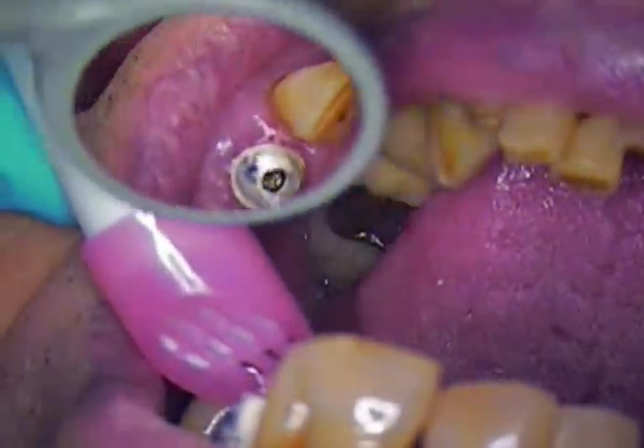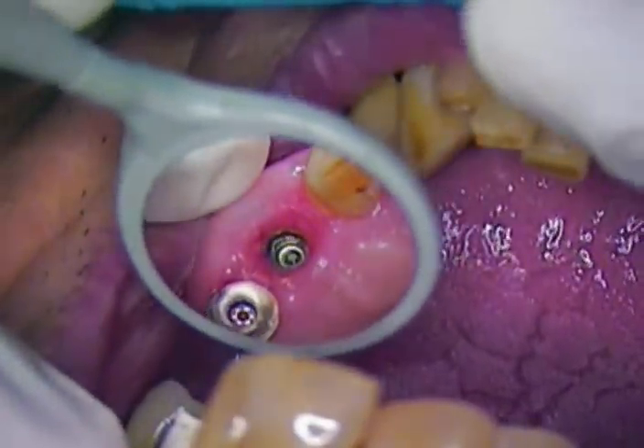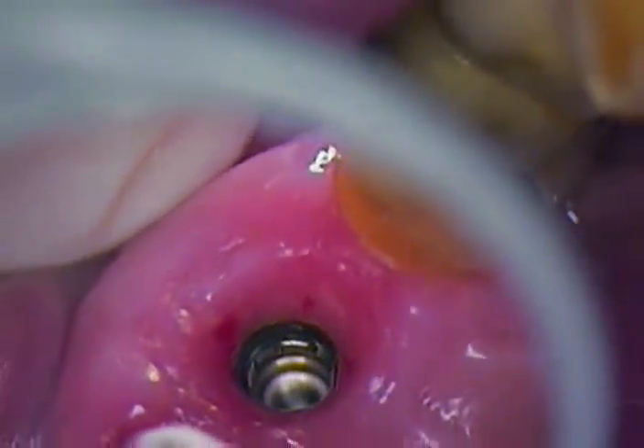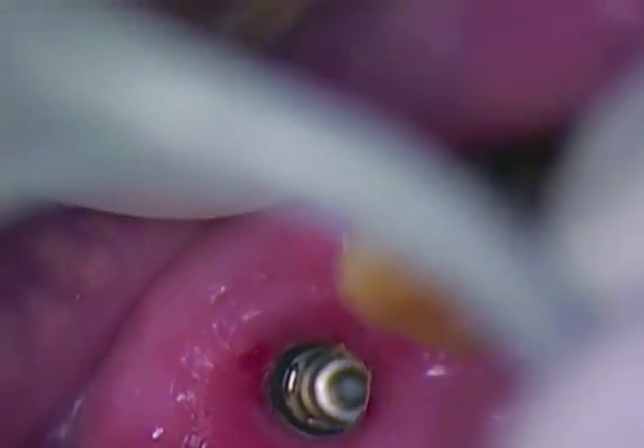We're back in the mouth. Take the first one off — and take a look at that. We're going to have a micro suction inserted and an air water syringe tip also in the same diameter. He's got a little bit of maybe surfacing of the graft material — you can see a little bead of blood right there. That might be some scaffolding done in the labial aspect, although there's some on the lingual as well. Could be some of the graft material surfacing.